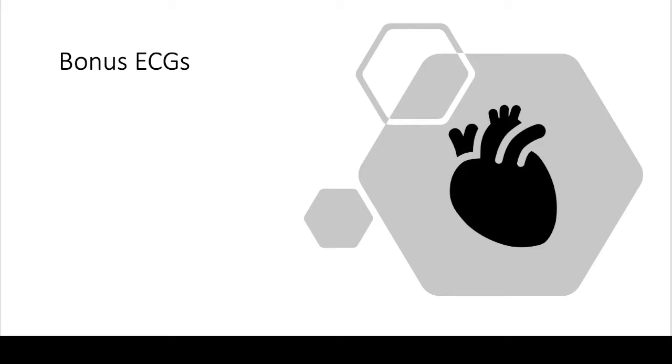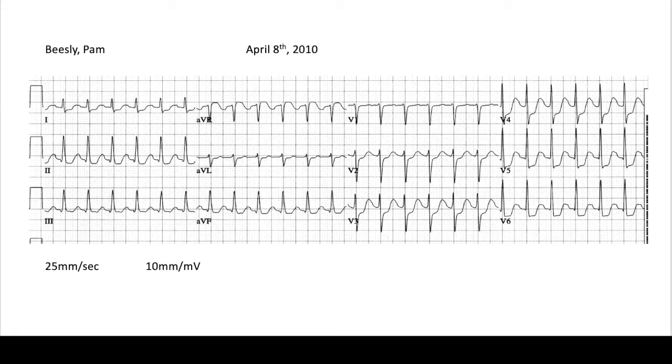What I want to do now is go through some example EKGs using the whole method that we have here, to show you how going through this method works, and also show you some other EKGs that are important to know that we haven't really covered yet. So let's start off with this first person. The first thing we do when we look at an EKG is name and date. We see the name, we see the date, then we quickly glance at the speed and gain — we see that those are normal — and then we can start looking at the EKG.